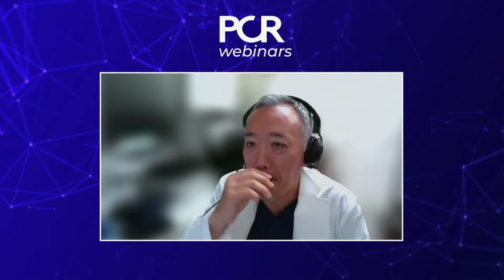So I was asking that because in our practice we are still doing the coronary angiogram. So maybe we need to move forward. When we are still dealing with a whole patients with a lot of calcification sometimes, and when you get calcium, for the time being, we found it difficult to really analyze and make sure that you don't have any significant disease. So for proximal vessels, I think it's very useful, but we are all learning together. So I guess I will try to get rid of that coronary angiogram and to rely more and more on CT.